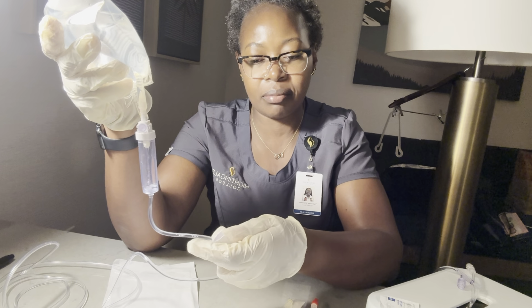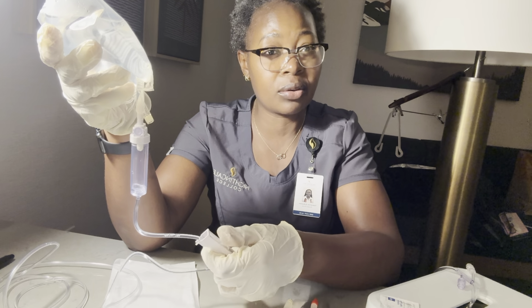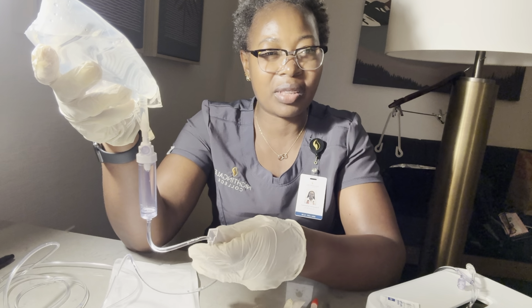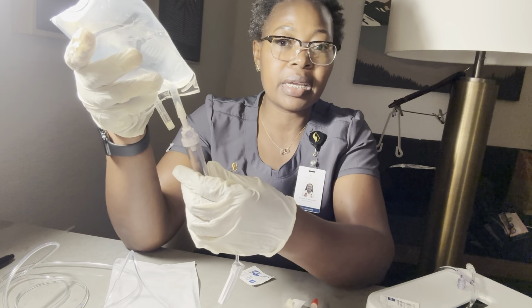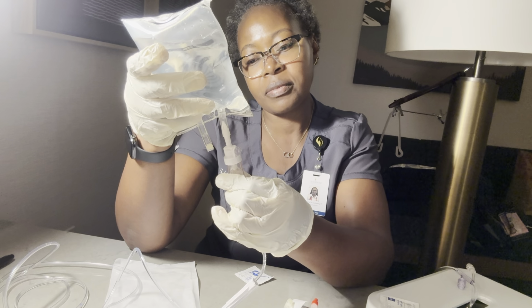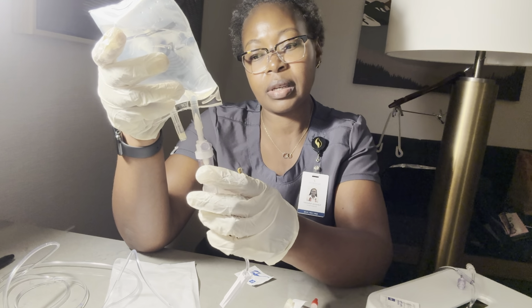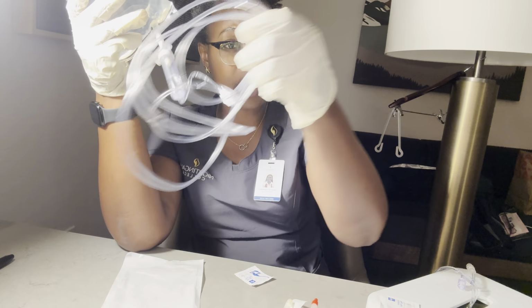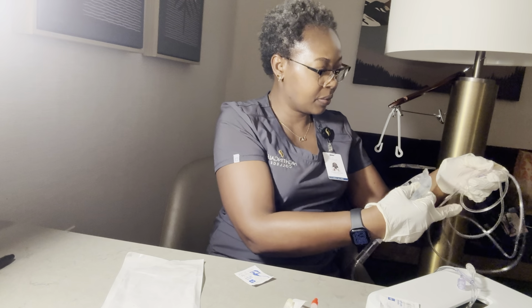I'll make sure that my clamp is closed before the drip starts running down. So I'll go ahead and fill the drip chamber halfway full, and that is it. I'll then prime my tubing to make sure that there's no air trapped.